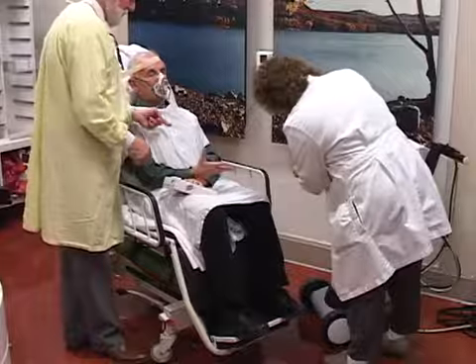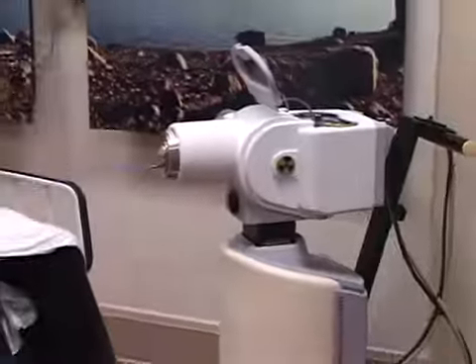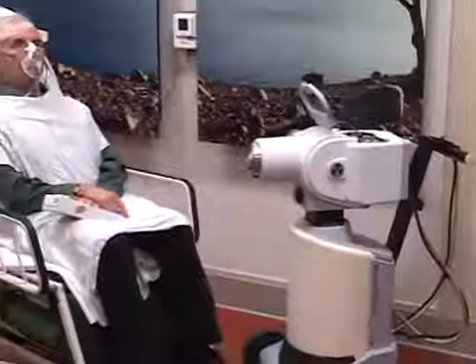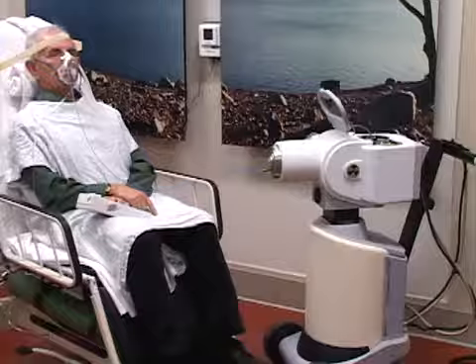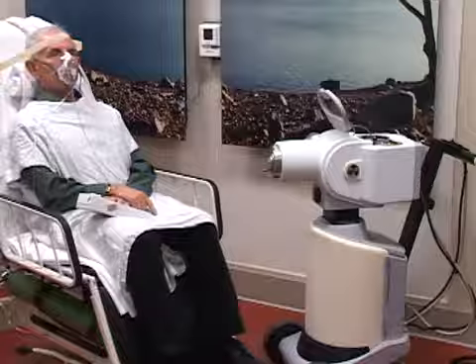The catheter is then attached to the high-dose rate brachytherapy device. Under computer guidance, the radioactive source is advanced through the catheter and positioned adjacent to the lesion. A very intense localized dose of radiation is then delivered to the endobronchial lesion with minimal damage to the surrounding structures. The computer then withdraws the radioactive source and stores it safely within the brachytherapy machine.